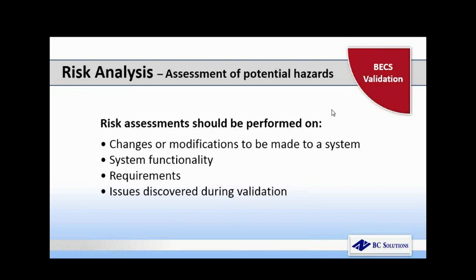And that will help you know whether or not you need to do. If there are no high risk or even medium risk items, if they're all low risk, you may not need to do a complete validation. If there are several high risk or even one high risk item, then yes, you probably do need to perform a risk assessment.